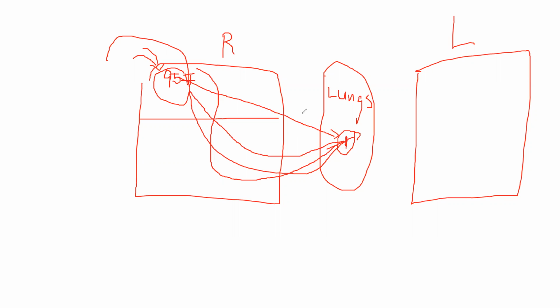So once again, yeah, Marian, it used to be a cold solution, but now we don't do that anymore. We just use a room temperature solution. It used to be that we iced it so that we could determine when it reaches that distal point of the pulmonary artery catheter.